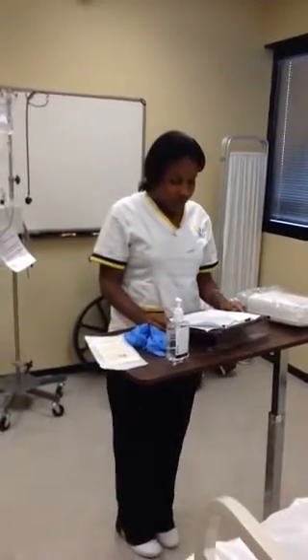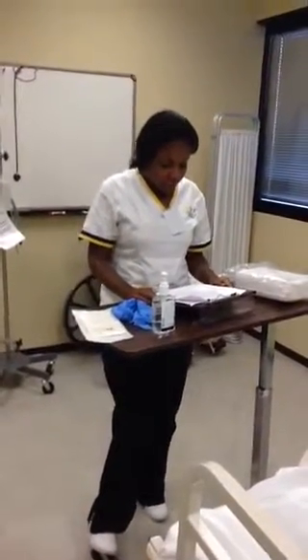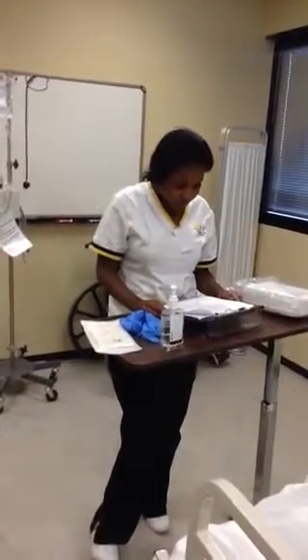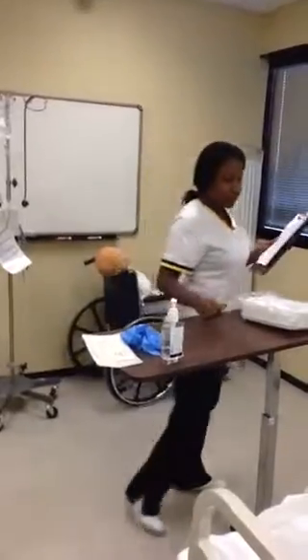Today I'll be demonstrating how to insert a Foley catheter. The first thing I'm going to do is read the provider's order. Order for Charlie Knight. Order for urinary retention. Order for Foley catheter. Now I'm going to the patient room.